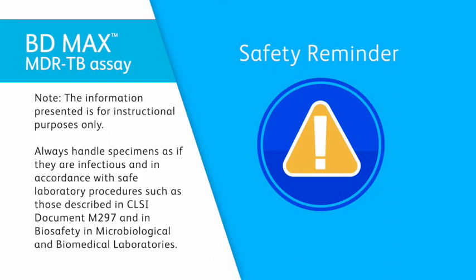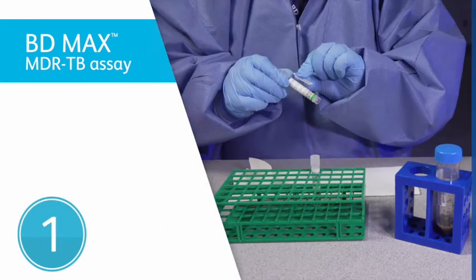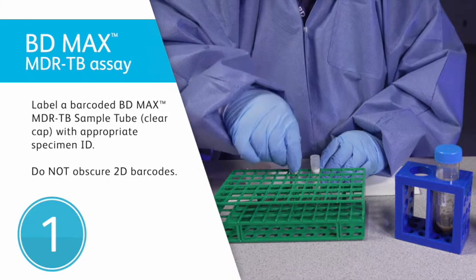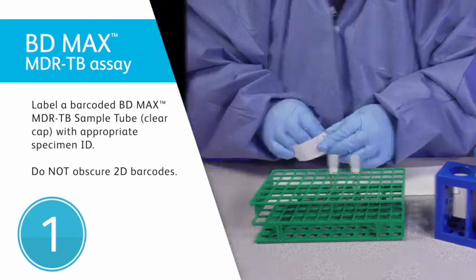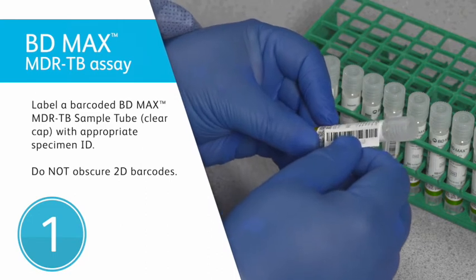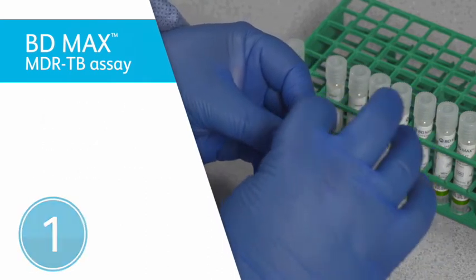To prepare the STR-treated sample, follow these steps. First, label a barcoded BD-MAX MDR-TB sample tube with the appropriate specimen identification. Be careful not to obscure, write, or label over the 2D barcode.